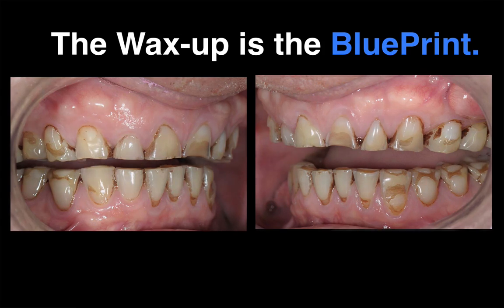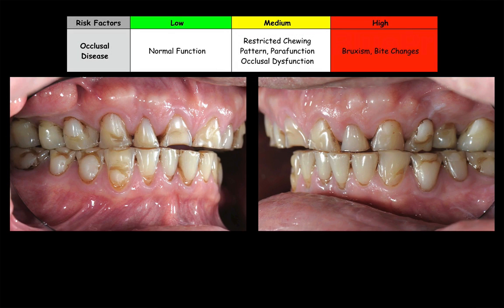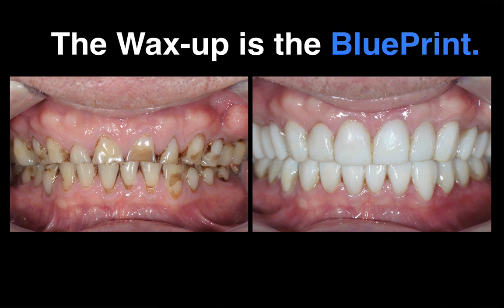So there's a lot of good teaching points on this case, and I'll talk about this case in maybe a few other dental excellence videos. But the bottom line for this video is the wax-up is the blueprint. So you look at, again, before pictures. Looks like bruxism if you were to look at the way the wear facets line up. Looks like bruxism. The wax up again was the blueprint to create the diagnostic provisionals.